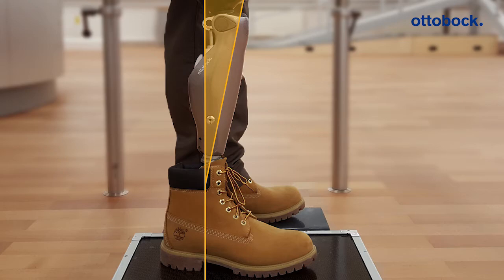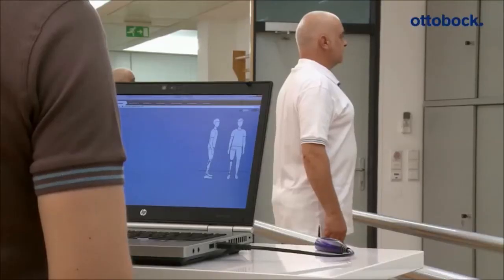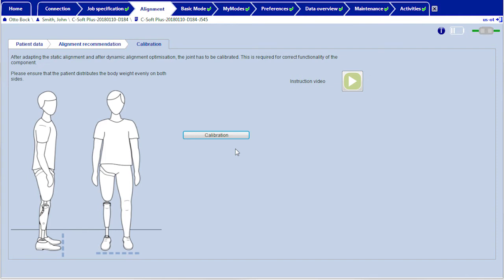Now perform the calibration in the adjustment software. If all of the criteria for a successful calibration are met, you can click the calibration button. Successful calibration is confirmed with the message calibration complete and the knee joint simultaneously emits a beep signal.